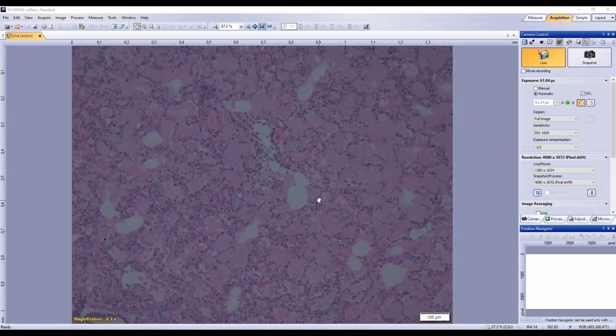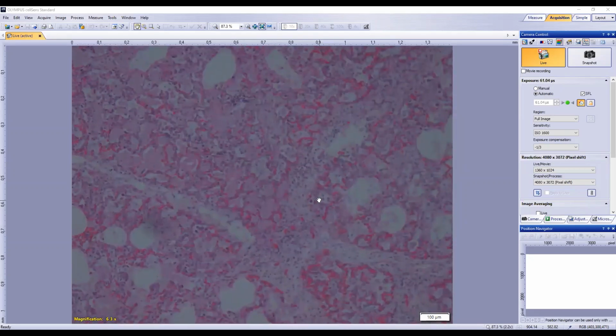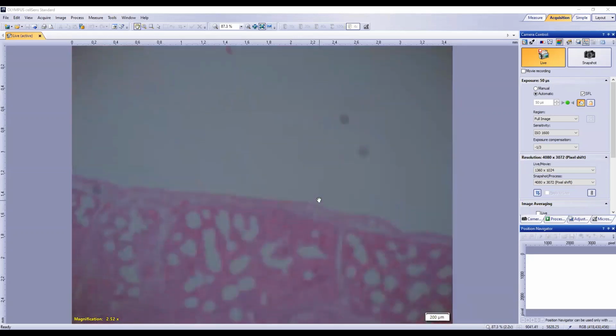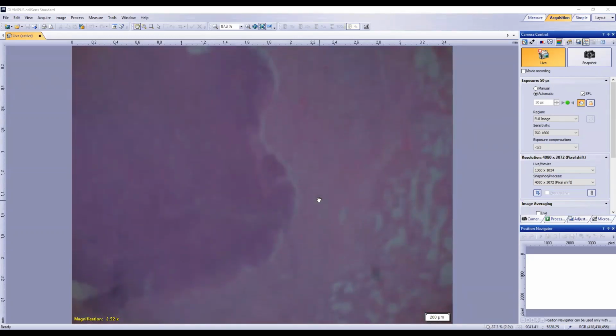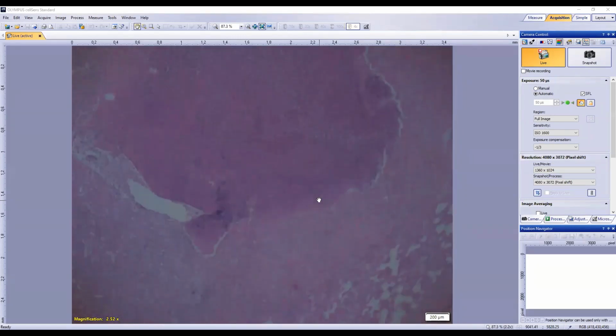Yeah, go ahead. I guess I haven't shown the other slide I got with this case. Oh yeah. There's a twist here. Nice. Okay, put it up. Put us out of our misery. Oh, there we go. Oh, I love it.